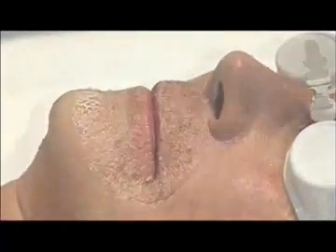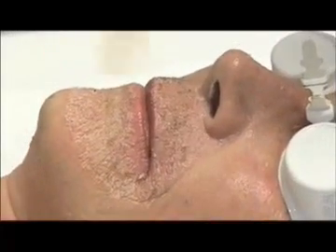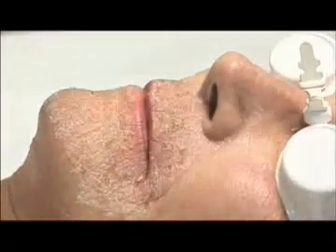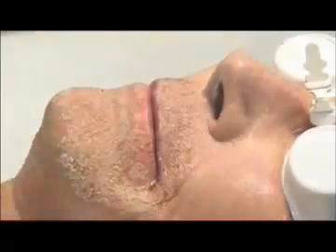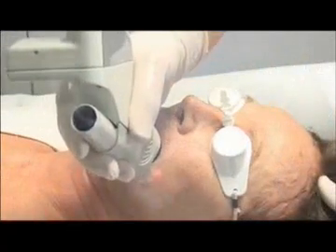We continue progressively, and here there is a limit, the bony ridge, which we must not go beyond. The apparatus has a collimated handpiece, which means that the adjustments must be done permanently, whatever the distance separating the handpiece and the cutaneous target.